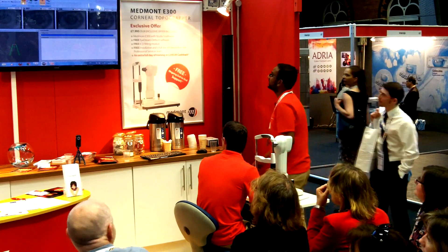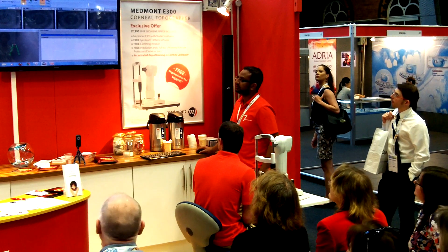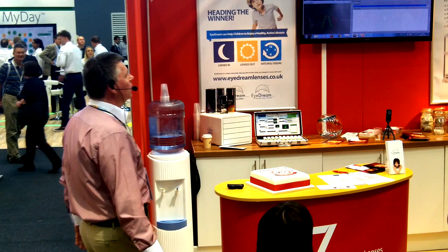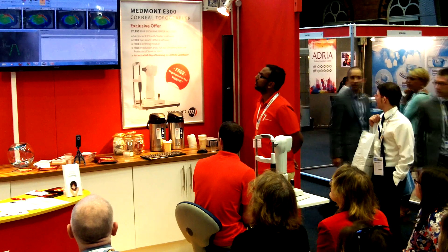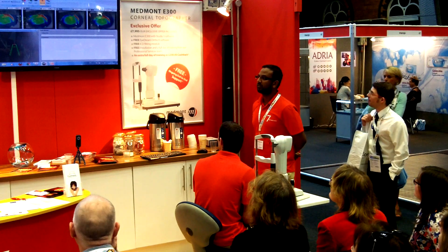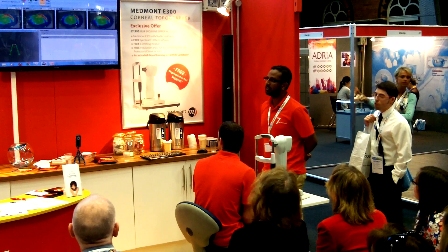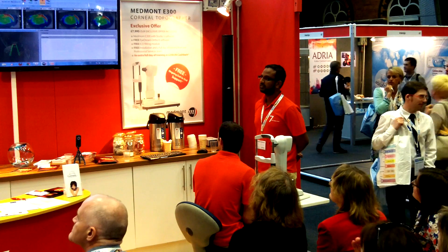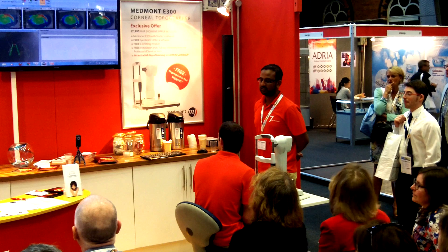What the computer's doing there — you can see if we go left to right, we've got 96, 97, 98, 99, and those are percentage scores. That gives us a pretty good idea about which one we want to save. We'll go for the far right — more data, more imagery. They're all fairly similar, and it's a slightly skewed image because, remember, Billy's actually got contact lenses in at the moment.